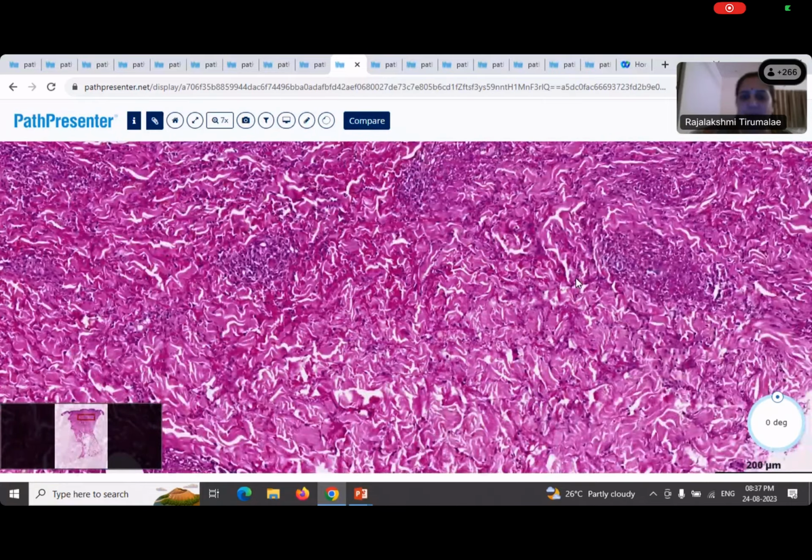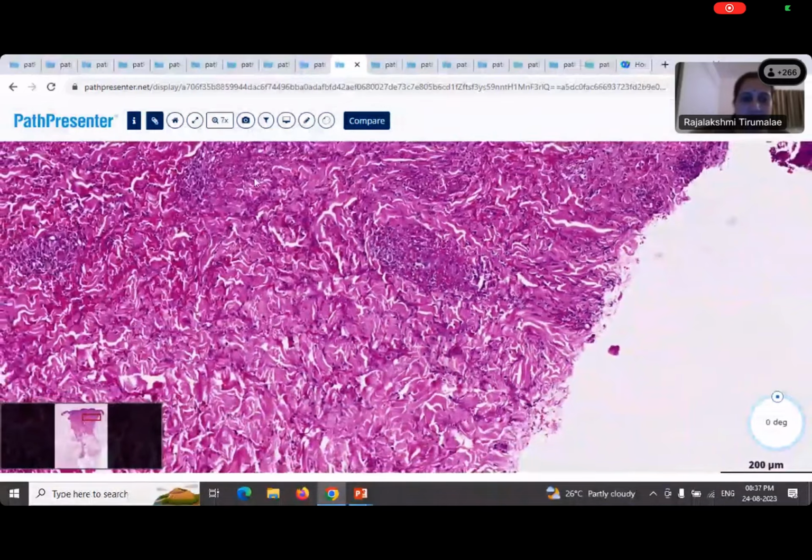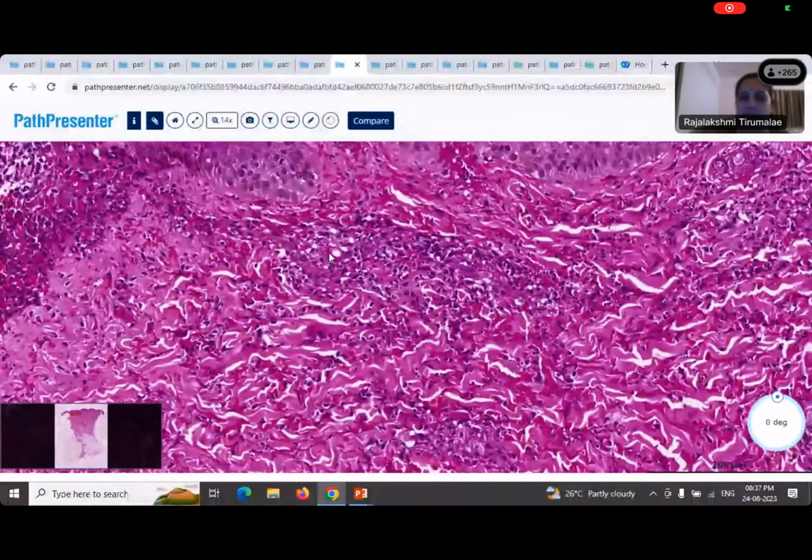Yeah, so are you seeing that here also? So there is fibrin deposition. I prefer to use the term fibrin deposition in the vessel walls. So that is what you're seeing here, isn't it? See, almost every vessel is showing that, and there's endothelial swelling.